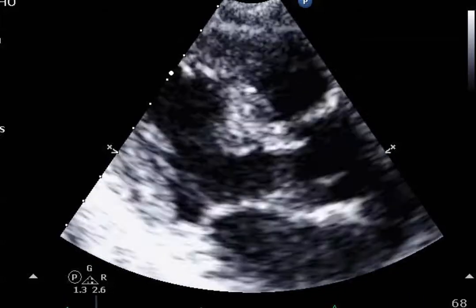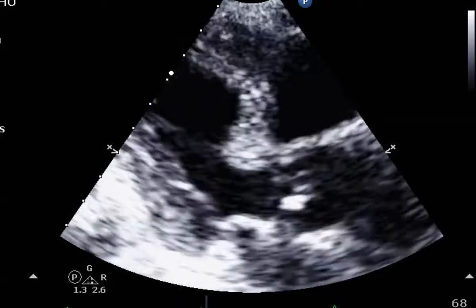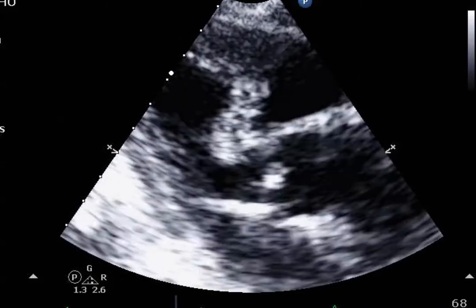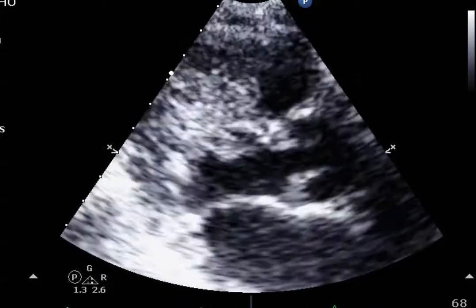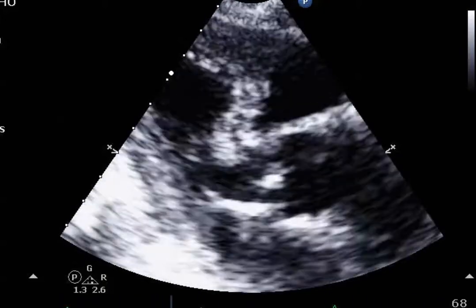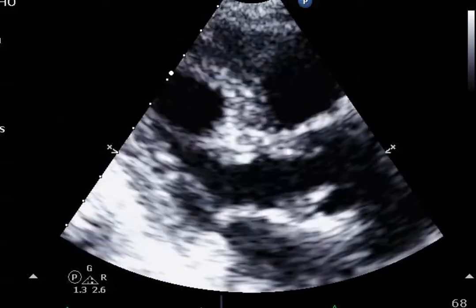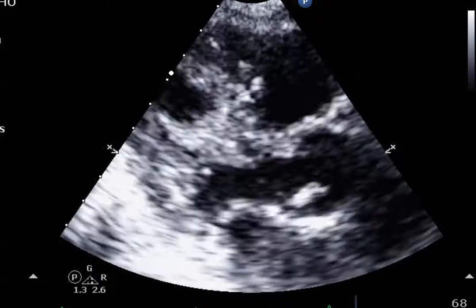Hi guys, I want to show you this echo just for some technical issues and things to consider when imaging someone like this. One of the things that caught my attention was how small the cavity is. This is a rather elderly woman, 72 years old, with a very small LV cavity. So immediately we start thinking about whether or not there is LVOT obstruction because of either asymmetrical septal hypertrophy or just a very small underfilled left ventricle.